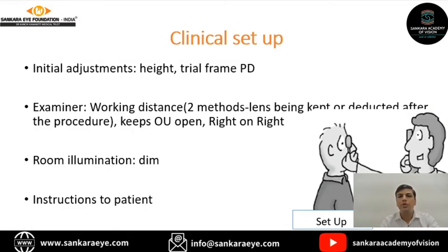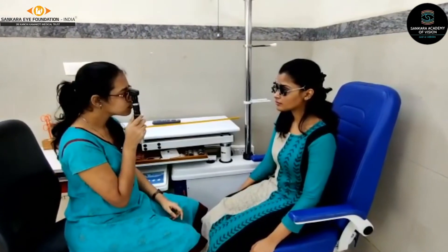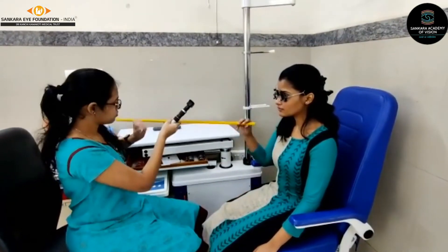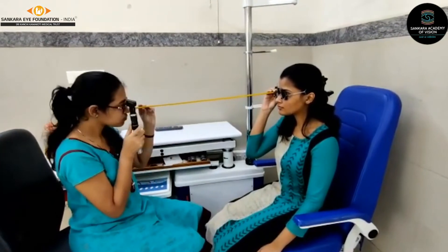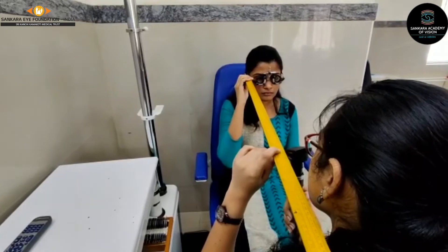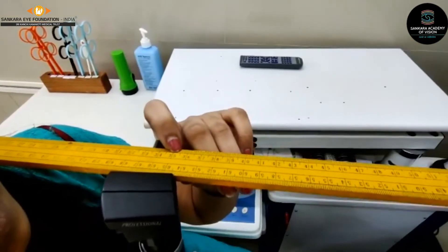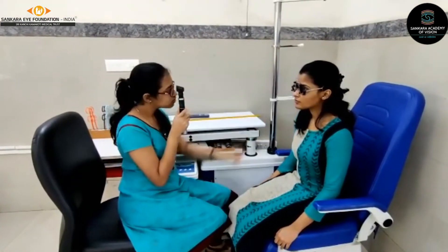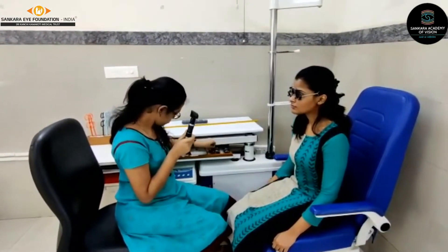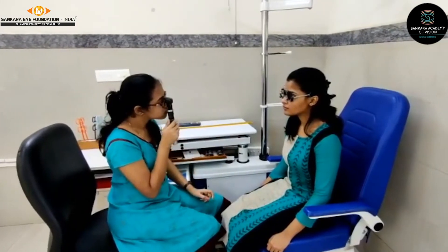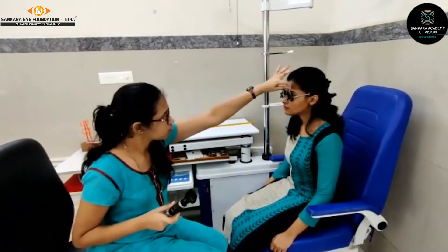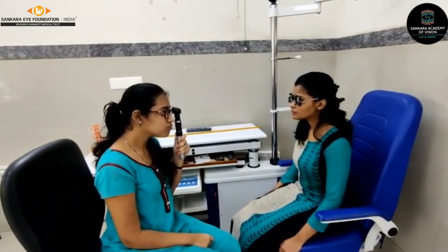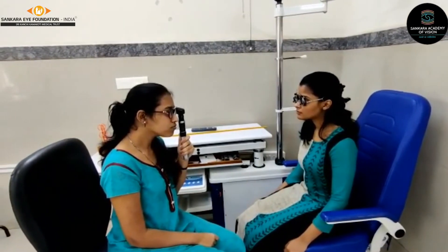In the demonstration video, the examiner uses the retinoscope to look at the right eye and measures the working distance, which is very critical. The shorter the distance, the more working distance power must be accounted for. The working distance is measured at 65 cm. The examiner then examines the subject's right eye refractive error while the subject's left eye looks at the target, before moving to examine the left eye.